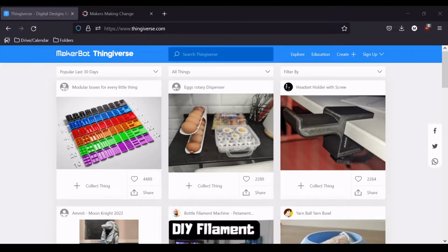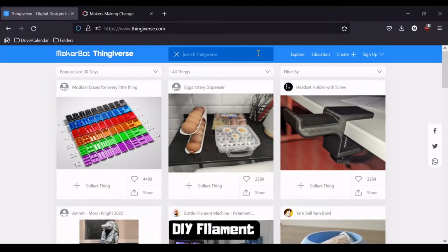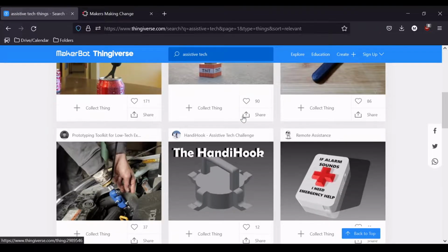So if you've been watching any of my videos, you might have heard me reference a website that's called Thingiverse. On my screen, I have it pulled up for viewing. Now there are a couple different websites that are out there, so I'll touch on these as well, but you can treat Thingiverse as kind of like a hub that attracts a lot of different users with a variety of different designs. Now it's not necessarily going to be the place where you'll find a focus on assistive technology, but it is a place that happens to host a lot of assistive technology if you know where to look for it.